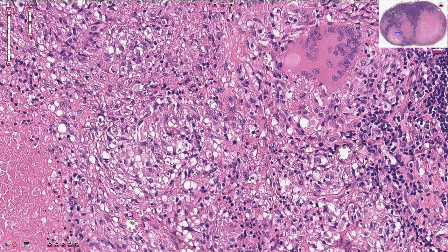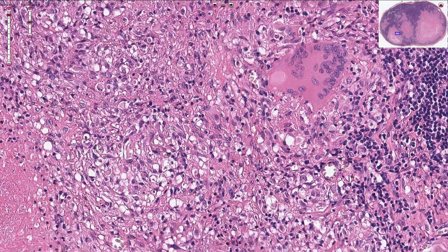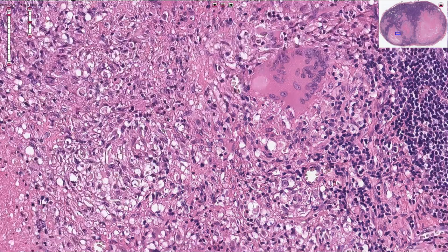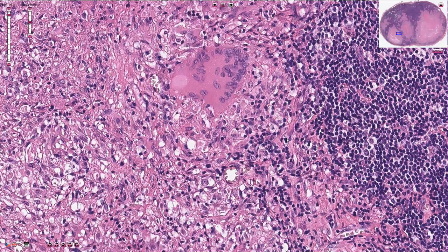Epithelioid cells are transformed macrophages that have lost phagocytic capacity, and this transformation is part of the T cell-mediated reaction. Th1 cells are responsible for production of cytokines that drive this process, and we can see those lymphocytes here.